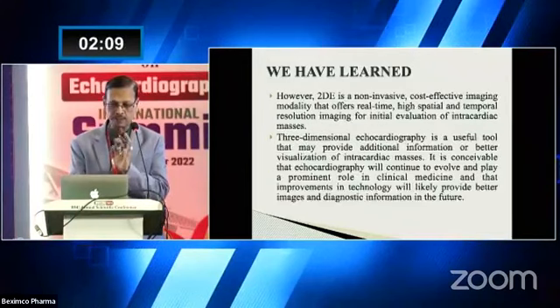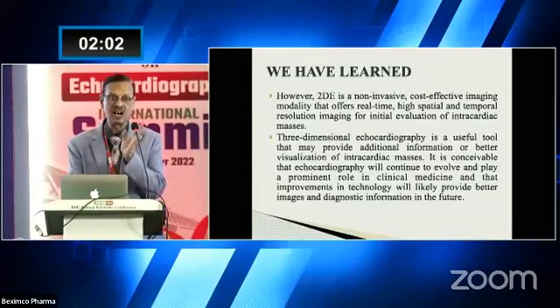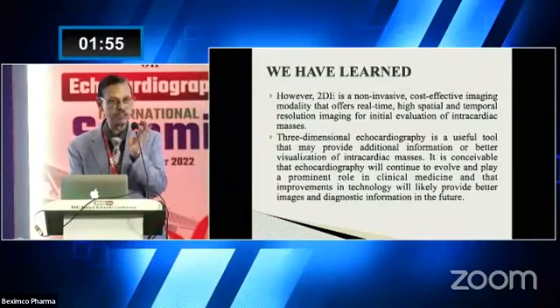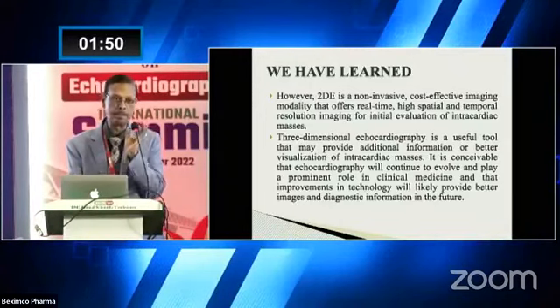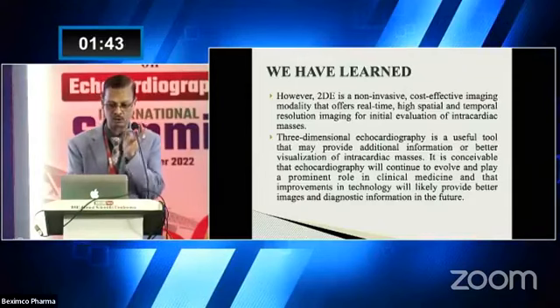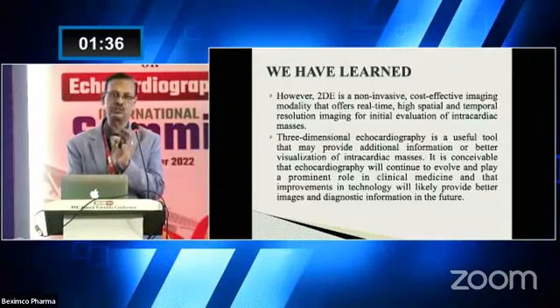Each technique has inherent advantages as well as limitations, including expense, radiation exposure, image acquisition time, and lack of portability. However, 2D is a non-invasive, cost-effective imaging modality that offers real-time, high spatial and temporal resolution imaging for the initial evaluation of any intracardiac masses. Three-dimensional echocardiography is a useful tool that may provide additional information or better visualization of intracardiac masses. It is conceivable that echocardiography will continue to play a prominent role in clinical medicine, and that improvement in technology will likely provide better images and diagnostic information in the future.